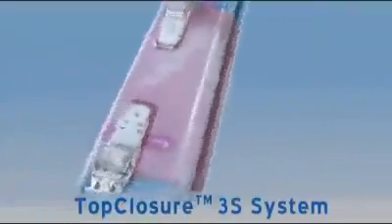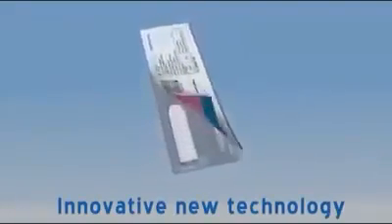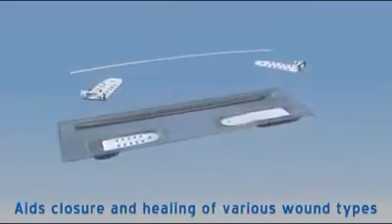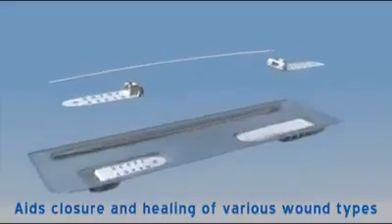The Top Closure 3S system is an innovative new technology created for skin stretching and secure wound closure. The system temporarily stretches skin tissue to aid closure and healing of post-traumatic, surgical, acute and chronic skin wounds.